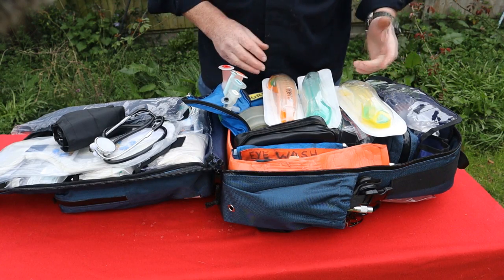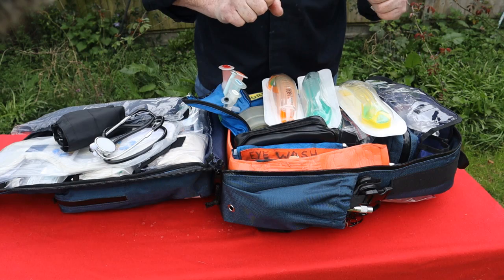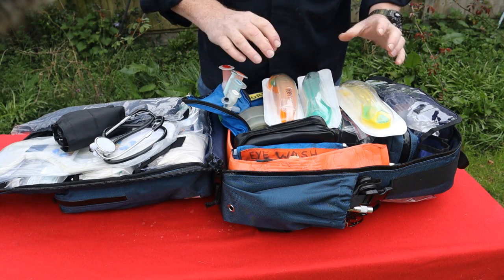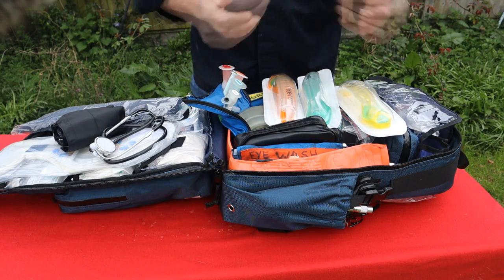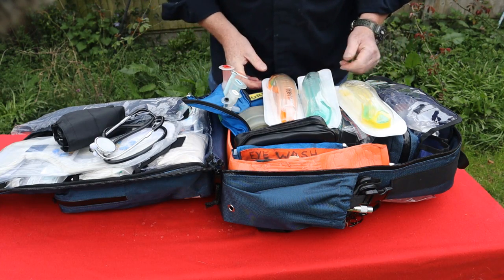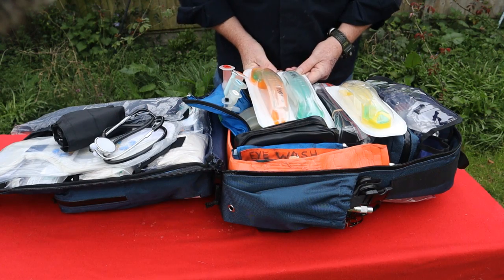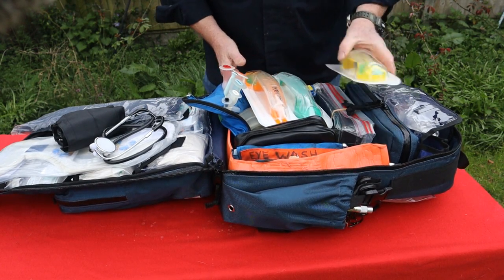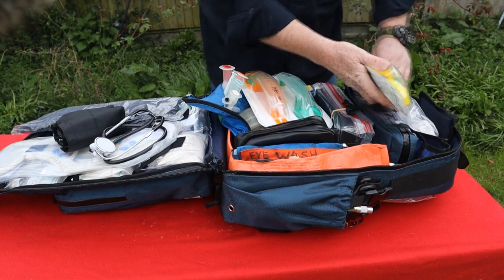These tubes are a big step forward. This will give you a very secure airway. It's not 100%, but we're not doctors, paramedics or anaesthetists. These are the three major sizes, but you can go down to paediatrics, children and babies. There's an extensive set of them. I've just gone for the small, medium and large for adults.